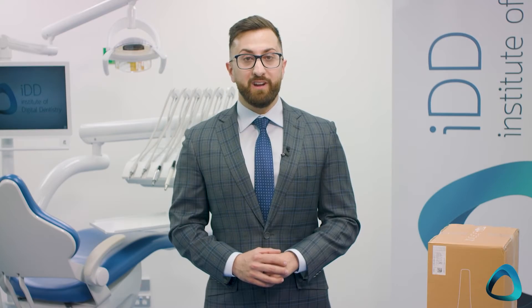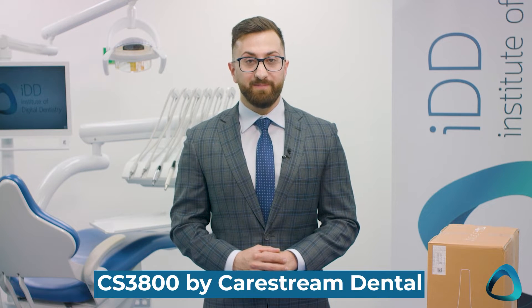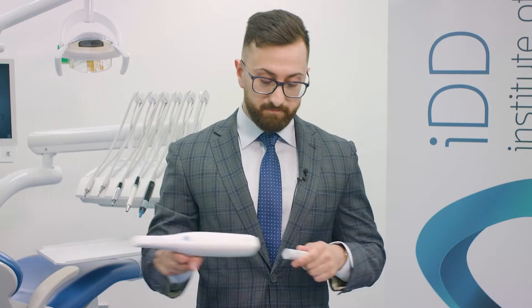The release of the Medit i700 wireless makes it the third wireless scanner on the market. The first wireless scanner was the Trios 4 released in 2019, and since then the CS3800 by CareStream Dental. Now we have the Medit i700 wireless. The concept of wireless scanning improves ergonomics significantly, and it also means no more issues with wires breaking, getting damaged, or losing connections over time.